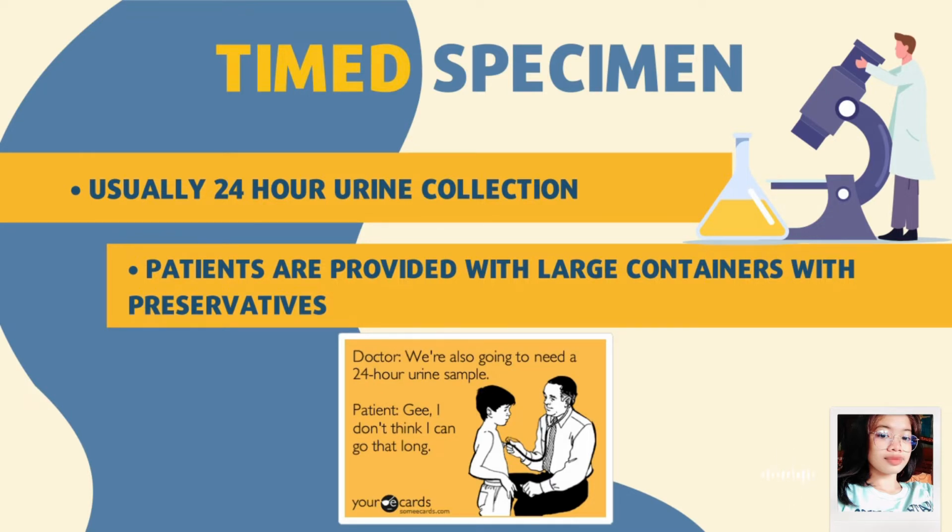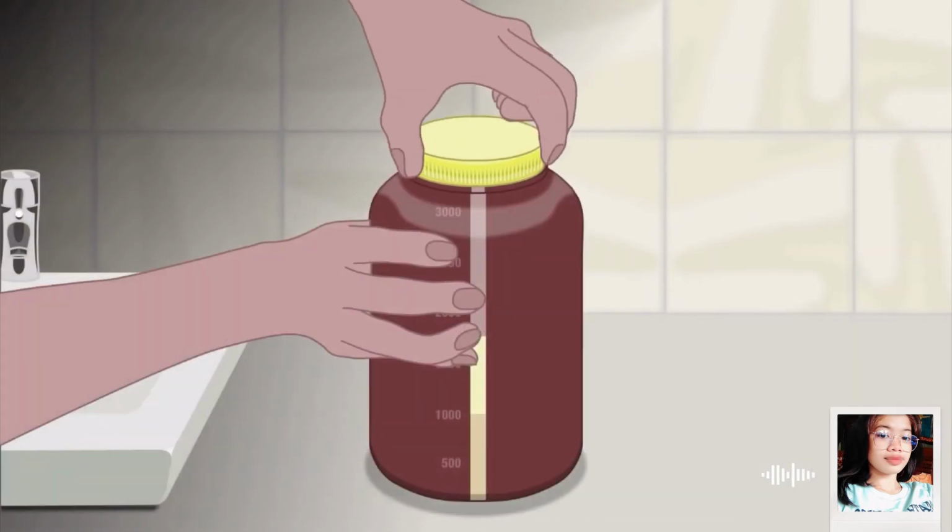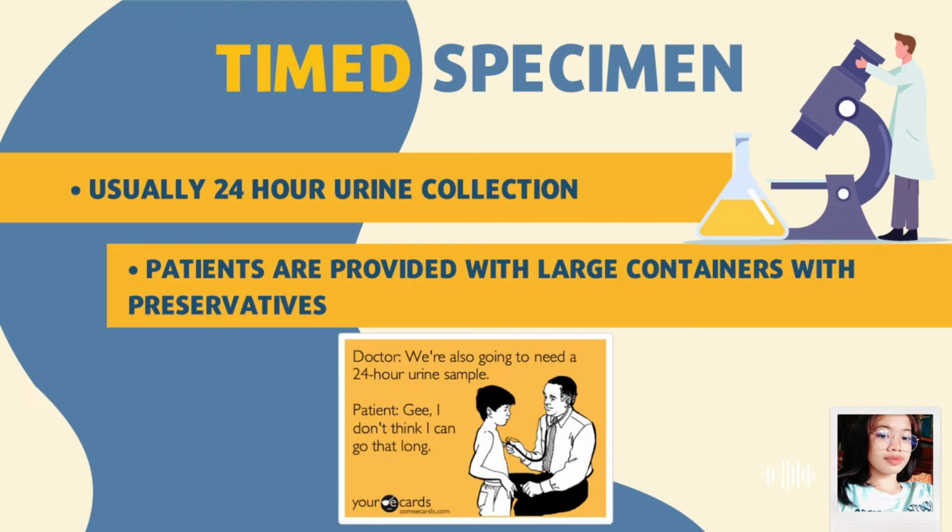Patients are provided with large containers with preservatives. It is important to provide the patient with a specimen container with preservatives in order to prevent the patient's use of a container from home that might harbor contaminants and affect the test results.